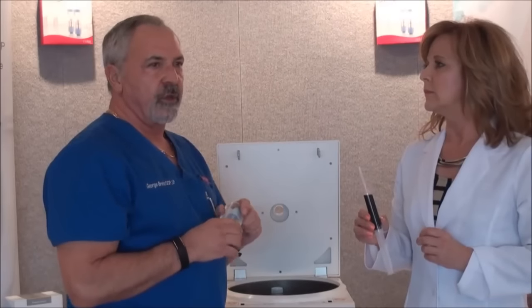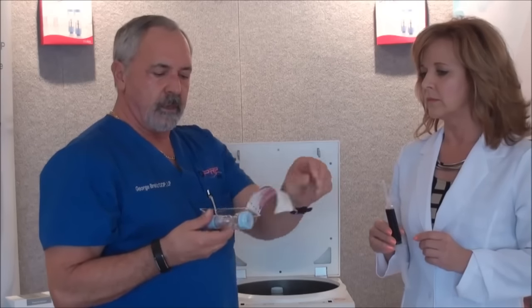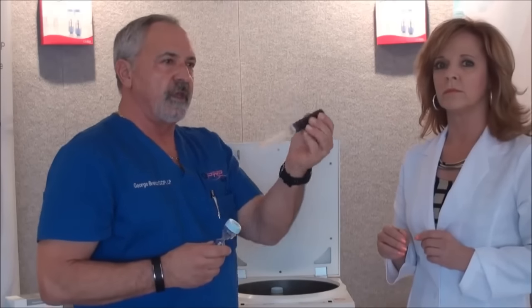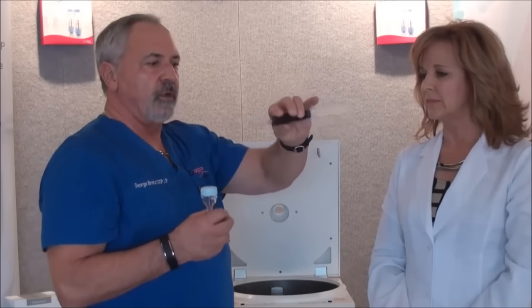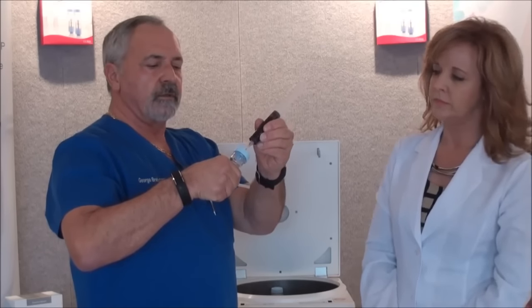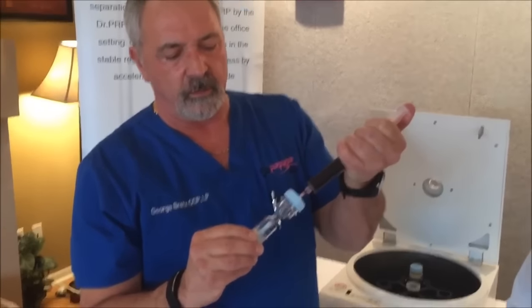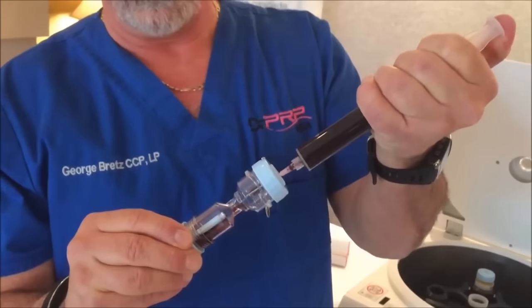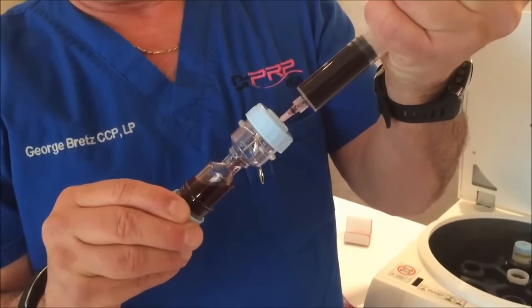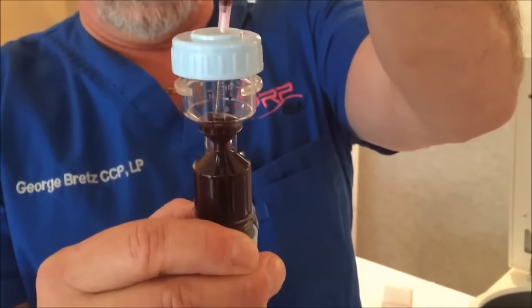Now that we've drawn the blood, we're going to show you how to get the first spin done. We peel the kit out. We've basically taken the blood from the patient. We're going to make sure we just mix the ACD up real good. We have an 18-gauge needle. What we're going to do is pierce the silicone cap. We don't want to create an airlock in the hourglass neck, so we're going to push the blood at a 45-degree angle slowly. As the blood rises, it's going to fill the lower chamber first, and then we're going to invert it straight up to 90 degrees until the blood fills up.